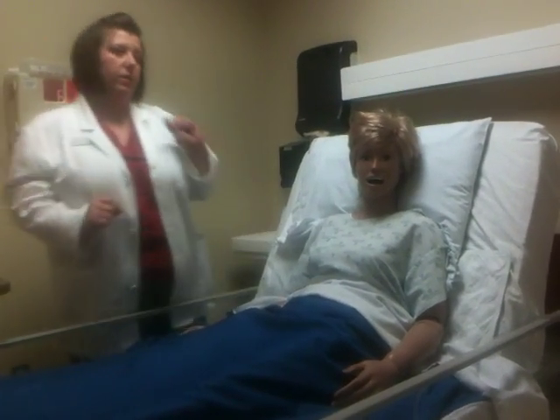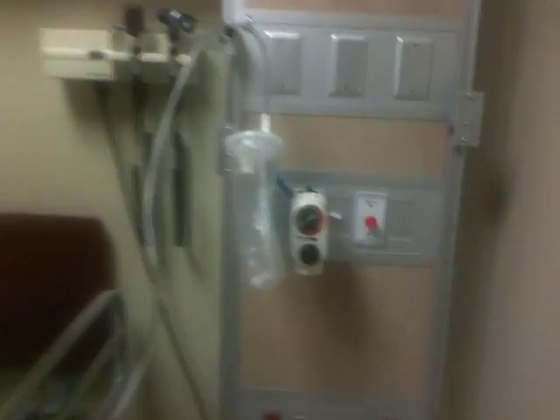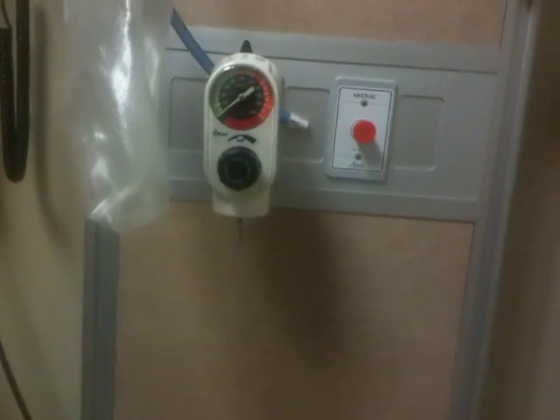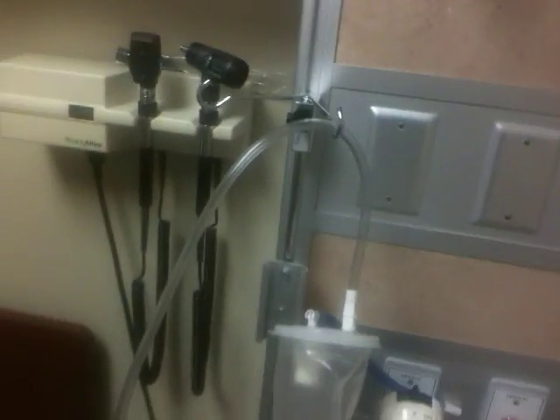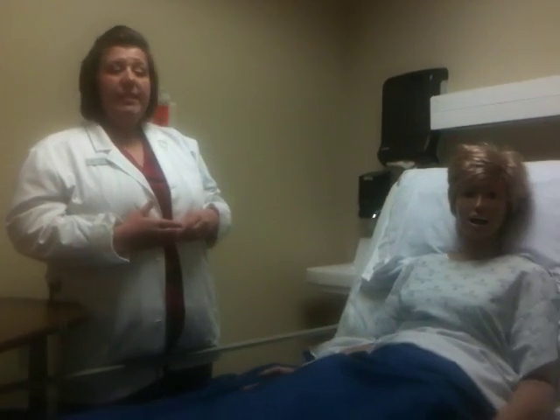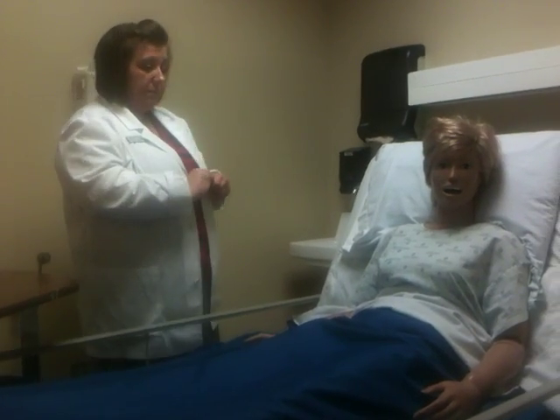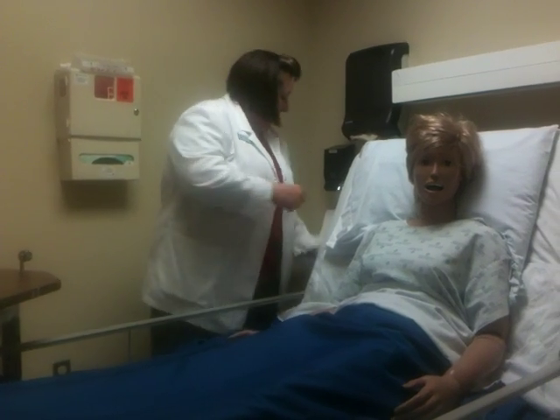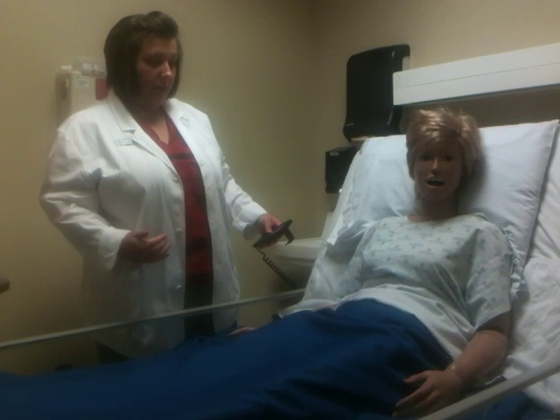Go ahead and set your suction equipment up. You would have a suction regulator. And then you would have a canister that would hook to tubing for your client. Remember we talked about in lecture that NG tubes are intermittent suction, not continuous. And the doctor will let you know whether or not it needs to be low, medium, or high. So we've got that hooked up. I'm going to go ahead and raise her bed up to a comfortable working height so that it's easier for me.